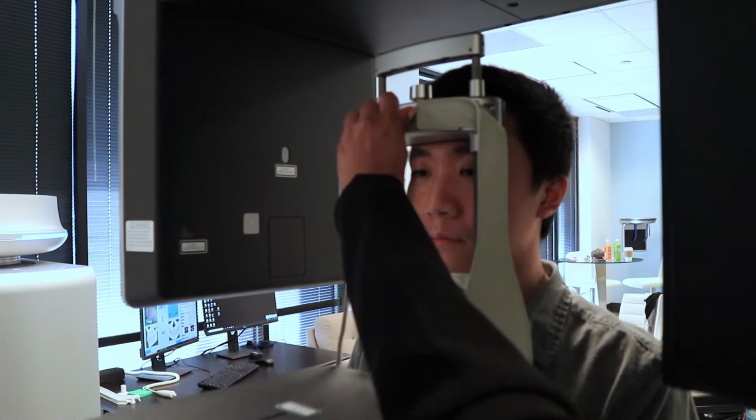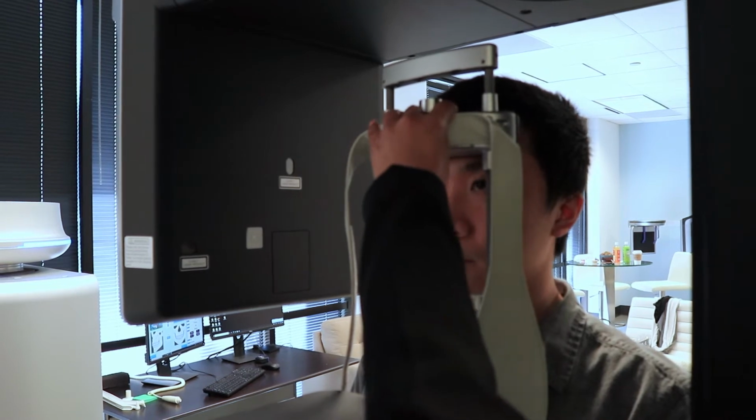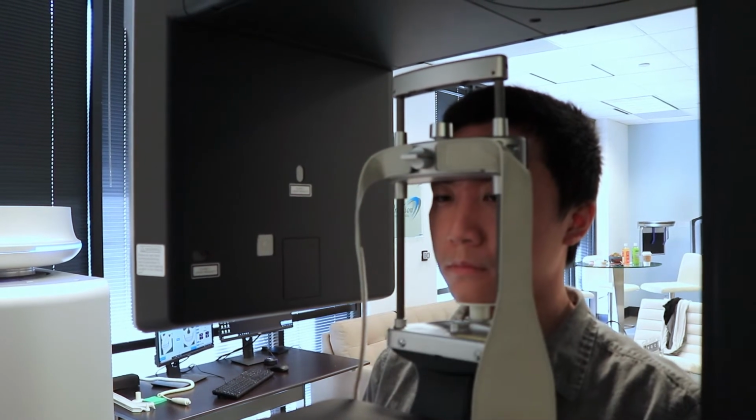Turn the front knob into the vertical position and move the forehead rest to the patient's eyebrow level. Turn the knob in horizontal position to lock it into place.